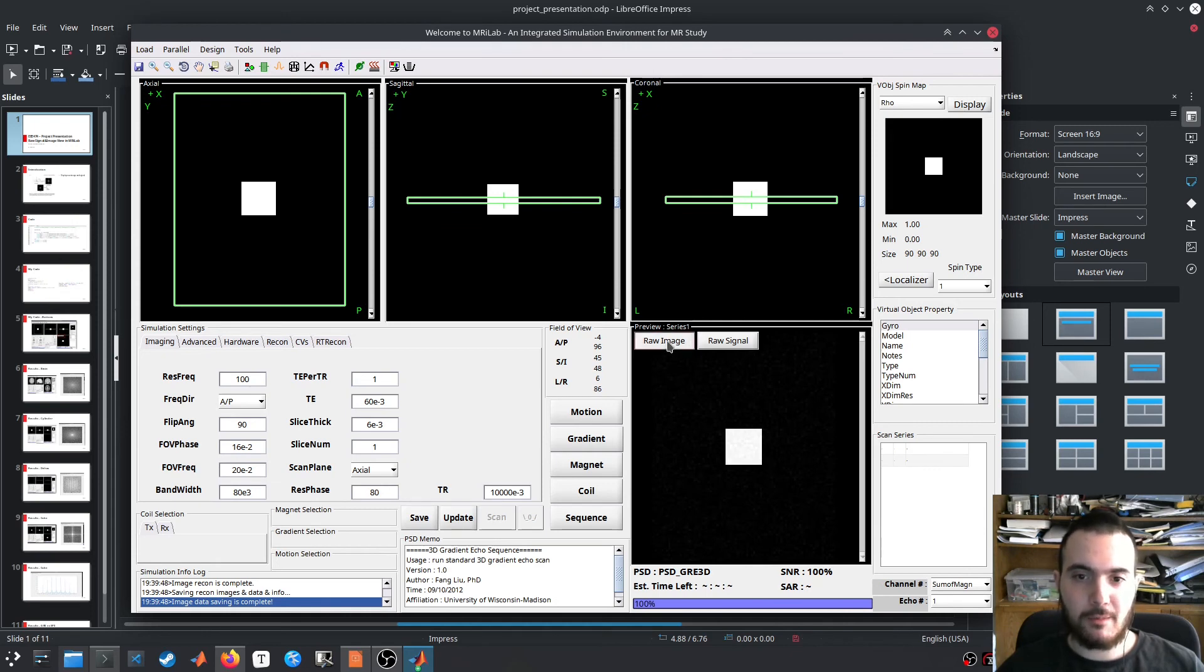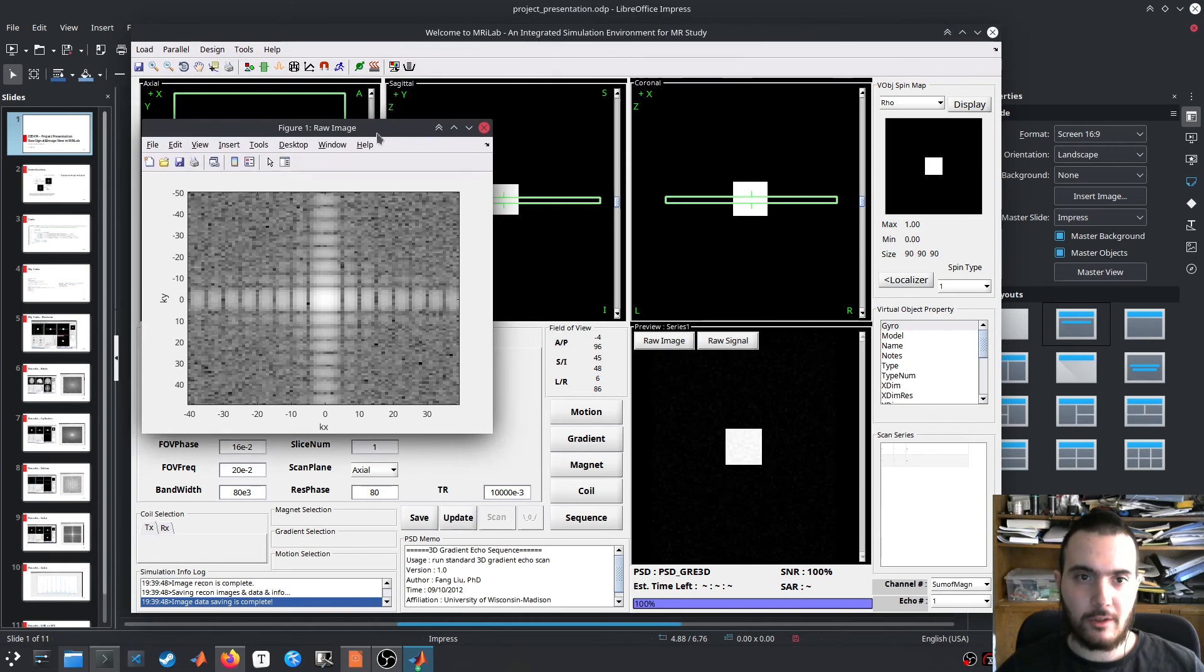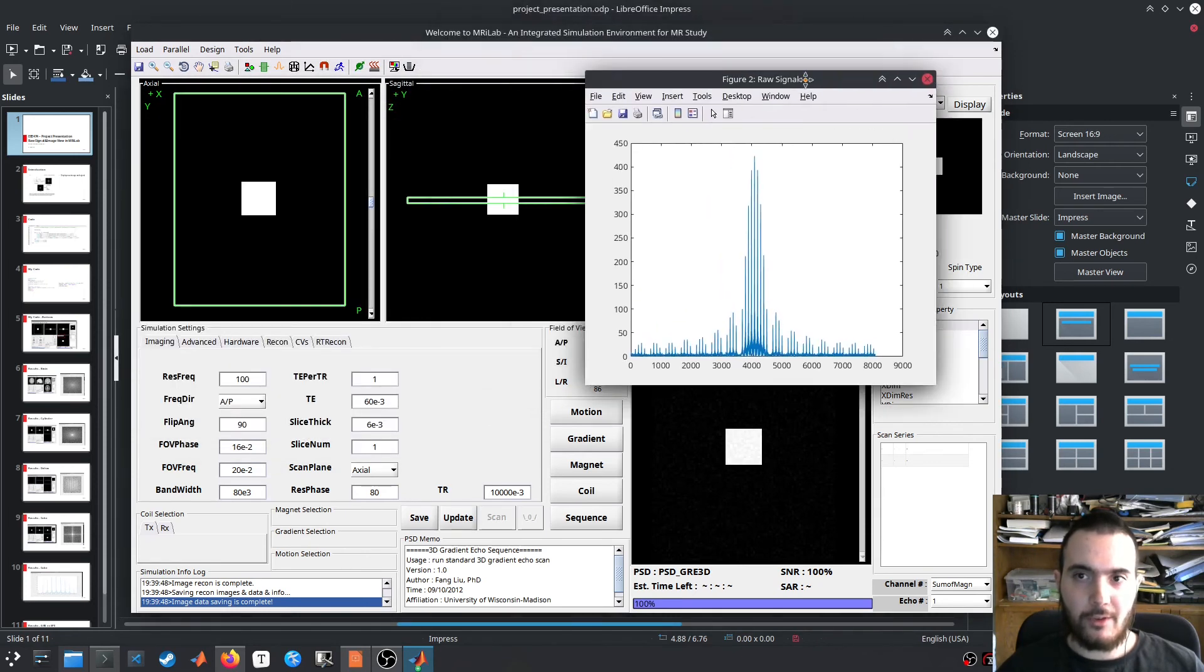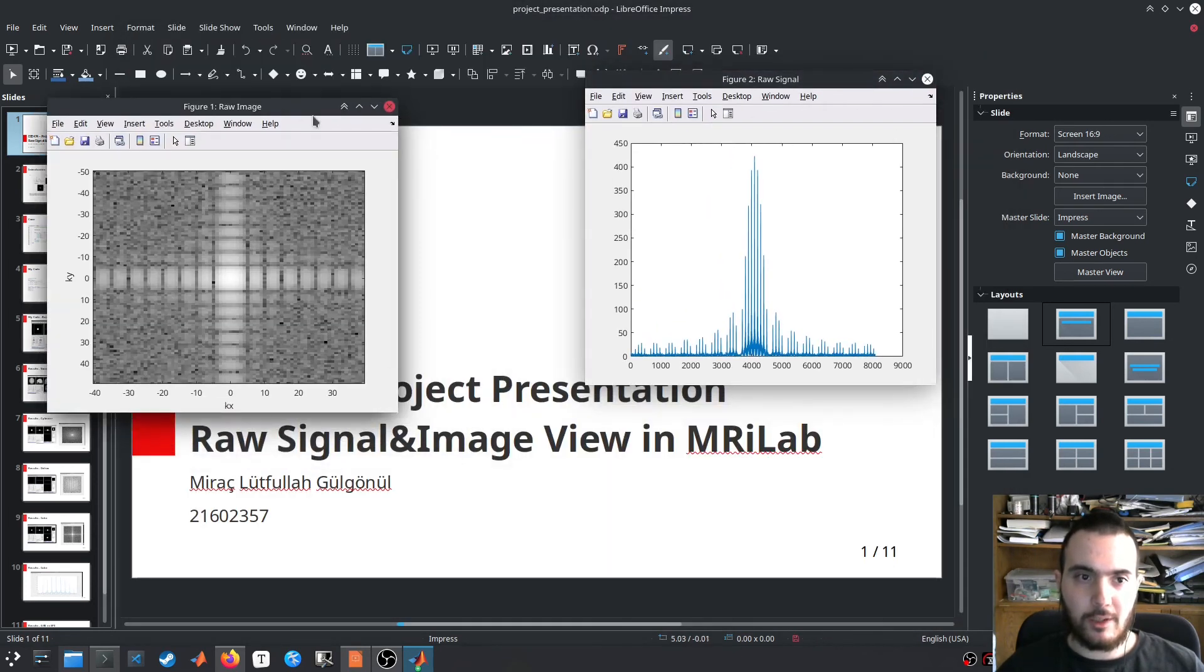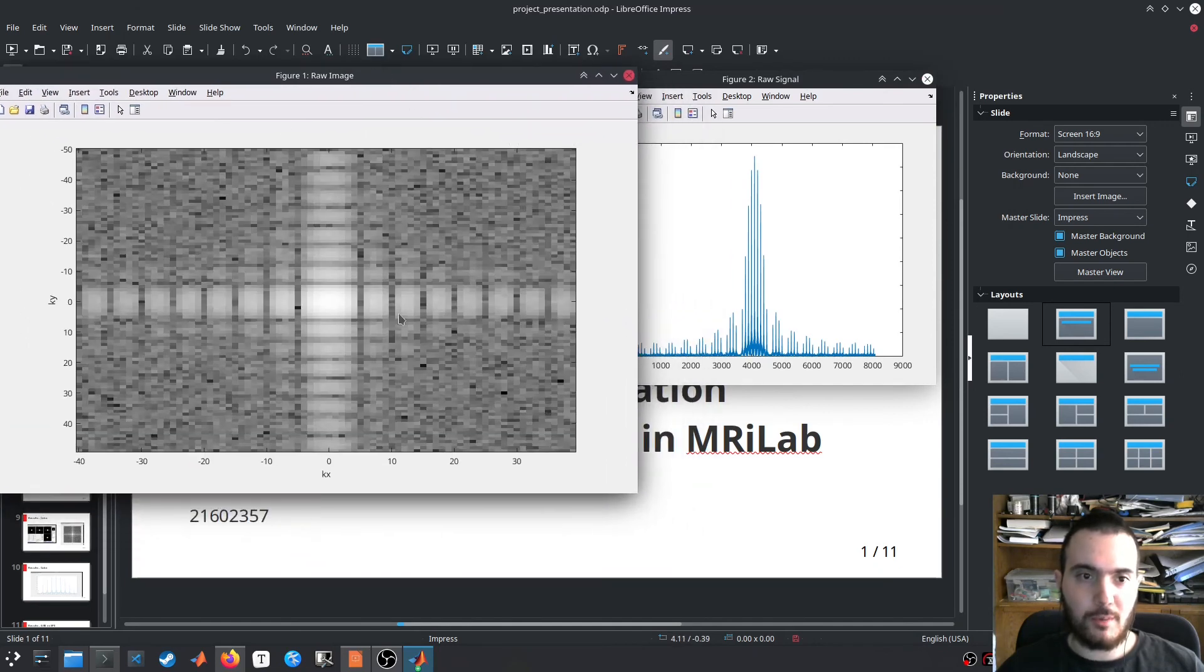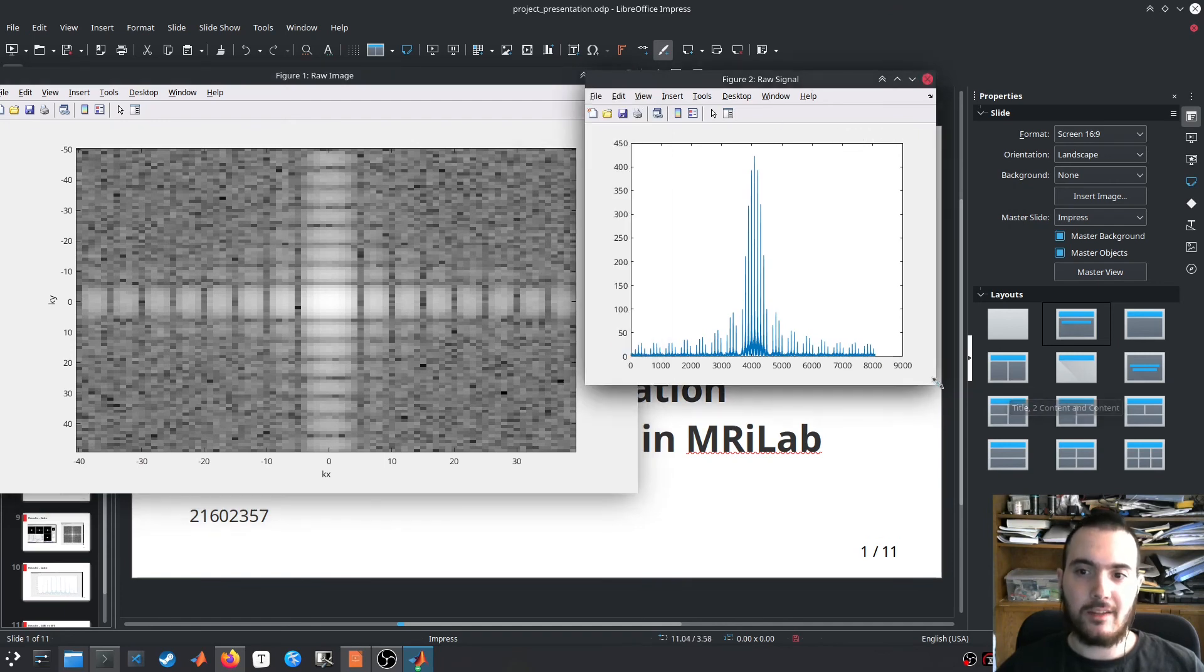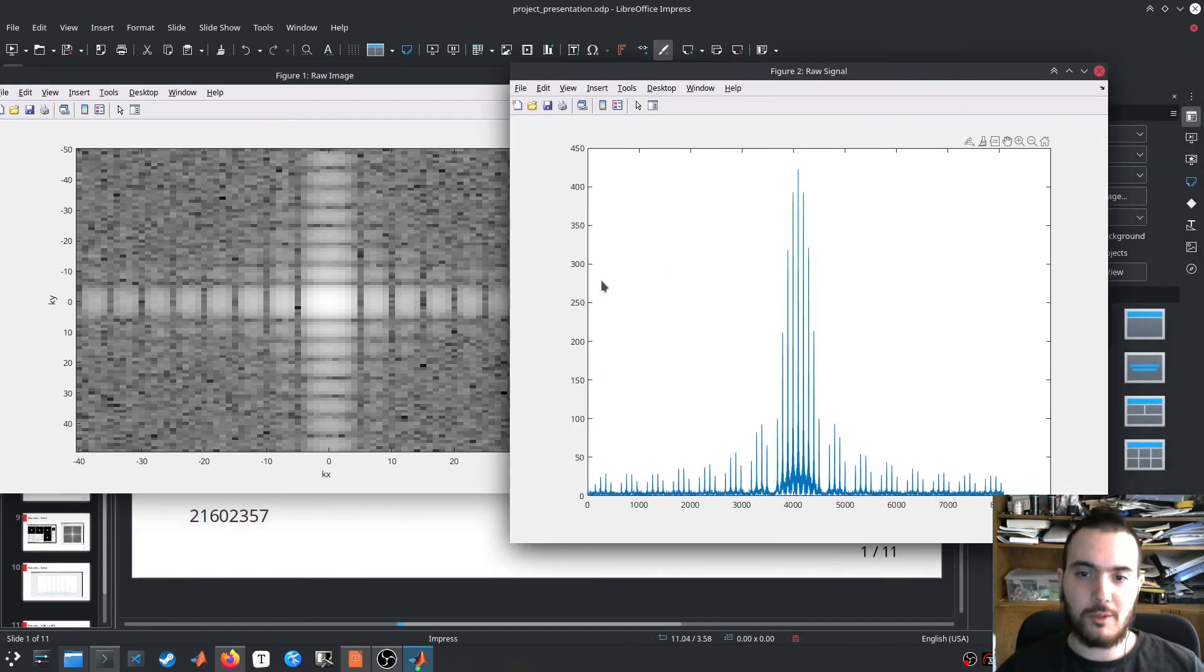Now by clicking these buttons we see the raw image first, and then the raw signal. As we look at them, we see that the raw image is indeed a 2D Sinc function corresponding to the rectangular nature of the object. And this is the raw signal magnitude corresponding to the gradient echo imaging.